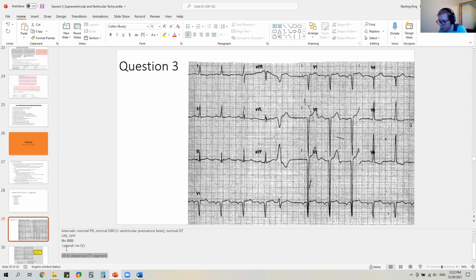And actually, so let's put that there. And let's check for the T wave. So the T wave is inverted, and this T wave is probably normal, but these two T waves are inverted. So T is inverted in 1, V5, V6. And now that I'm getting suspicious, I might even be thinking, if it's a depression in 1, it's there, it's a little bit, but it's very minor. So I'll just leave it at that.